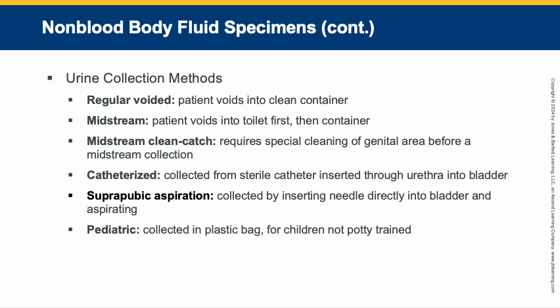So this procedure that we're going to look at, you're going to need to look at your textbook on procedure 13.2. It is on page 467. This is a step-by-step guide to instruct the patient in how to collect the clean catch using the vaginal cleaning method.